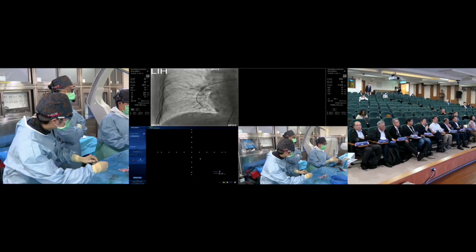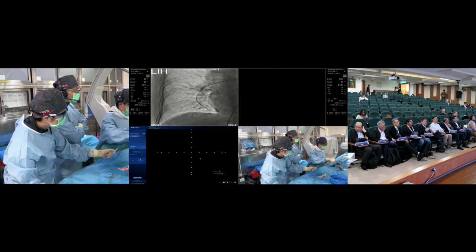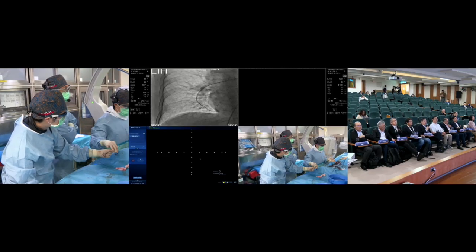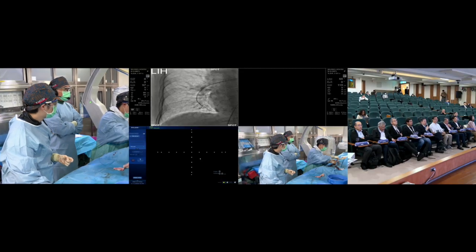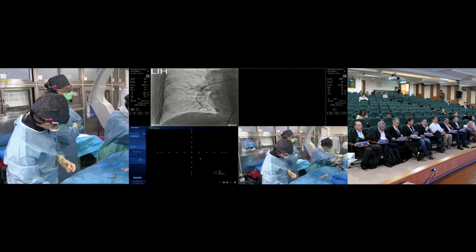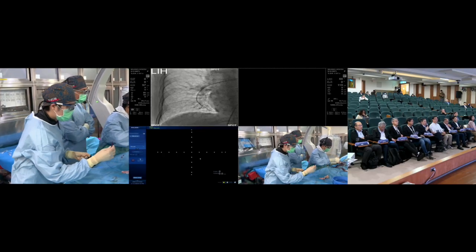We dilute it one by one with normal saline, because if we use pure contrast, sometimes we will use lots of contrast medium, maybe just after a few sessions of balloon dilatation. So we just dilute the contrast one by one.